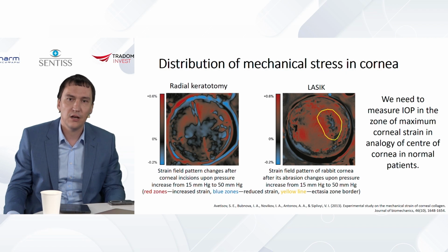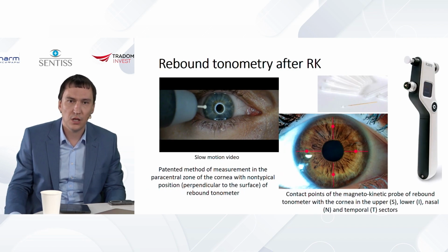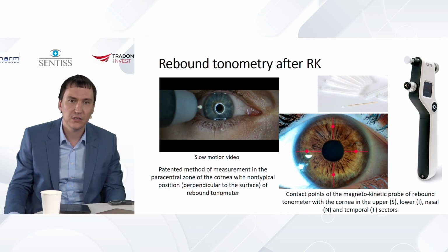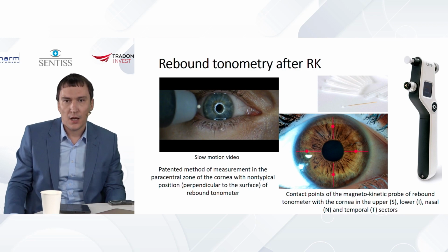So in these patients, we see maximum strain in the periphery, and we offered this approach, and we use this approach clinically. So this is the measurement in the mid-periphery in patients when they have scars, and patients after LASIK or keratotomy.